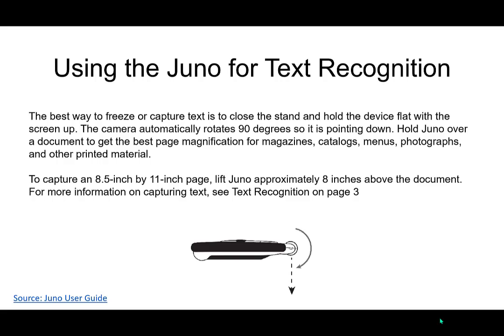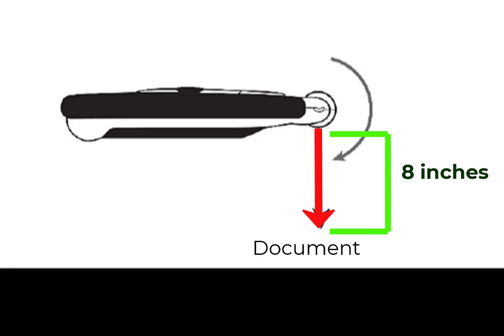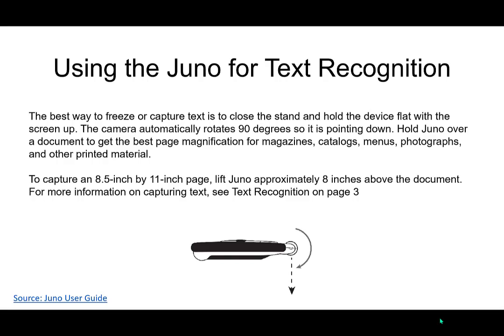The Juno can also be used for text recognition. The best way to capture an image is to close the stand, which are the legs, so make it completely flat, and hold the device completely flat again with your screen up. The camera will automatically rotate to that down position and face the item that you're trying to scan. You're going to want to hold the Juno about 8 inches above the page and have it positioned that way. It does take some vision to do it efficiently and effectively, but realistically, if you have no vision at all or very little, it still can be done with some training on how to hold the unit when you're scanning. There's a lot more information on text recognition later on in this presentation.